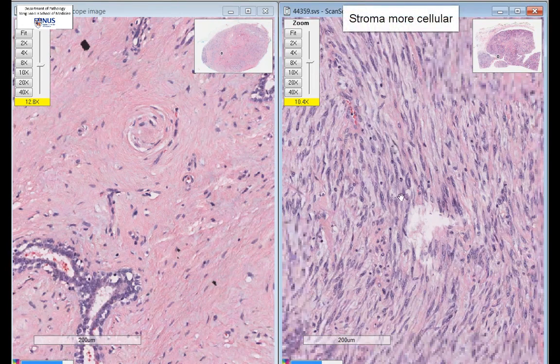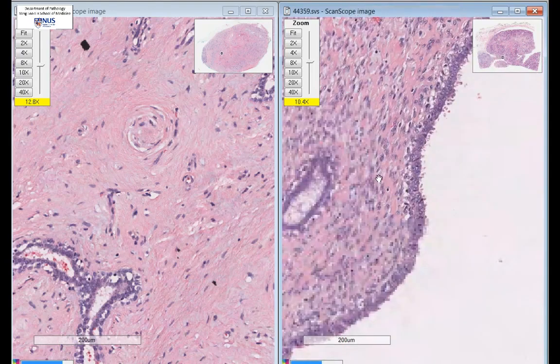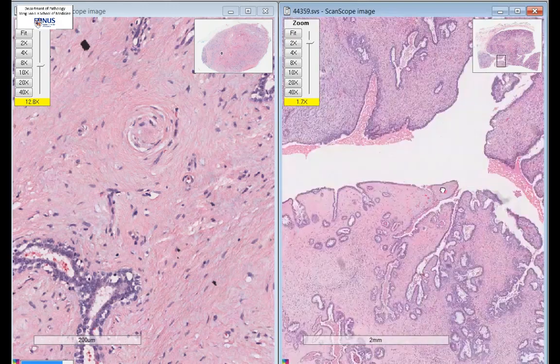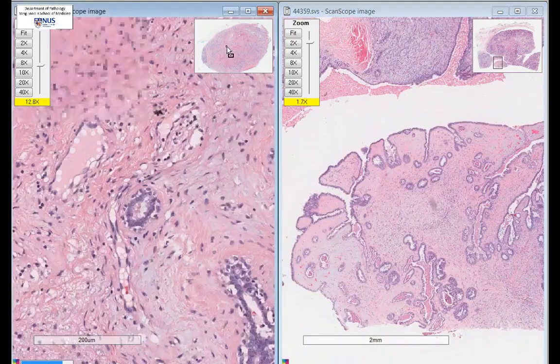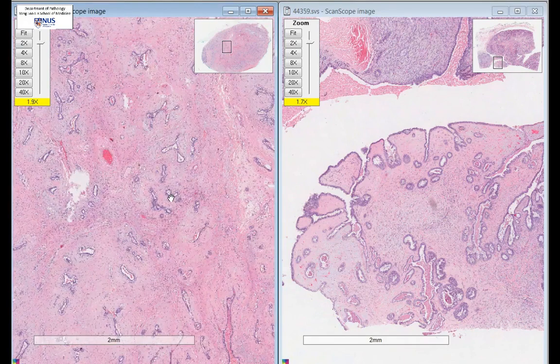The other difference is that in phyllodes tumor, you have a more intracanalicular architectural pattern, so you get these broad leaf-like areas, as opposed to a fibroadenoma where the pattern tends to be more pericanalicular, where the stroma surrounds compressed glandular or ductal structures.